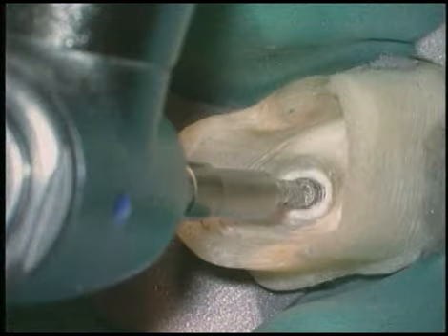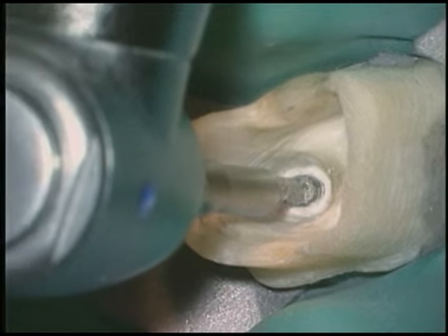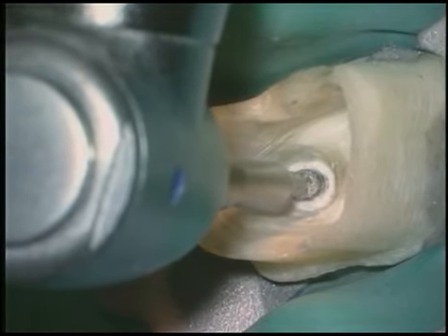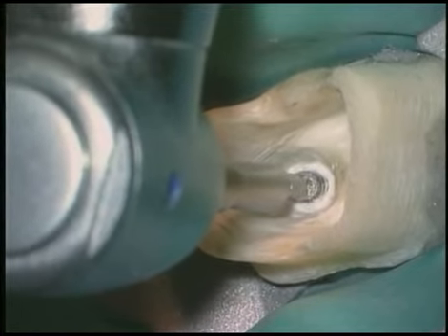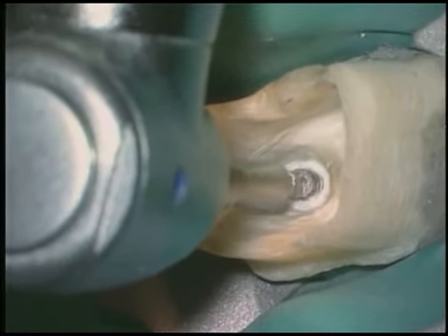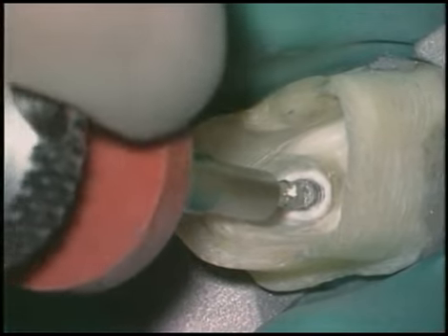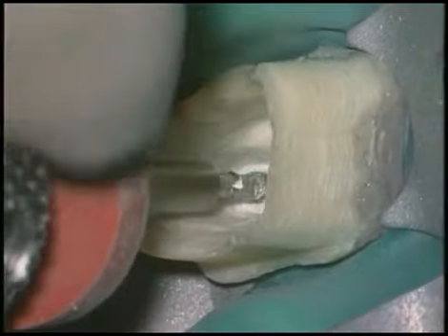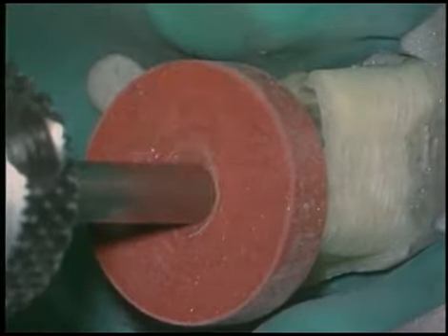If the post doesn't budge in that time, then we need a fallback option. The Cavo slow-speed electric handpiece can easily machine down a post with an appropriate trephine. Pumping action will allow the post to be machined down about 3 millimeters. Take the correspondingly sized tubular tap. Short little counterclockwise rotations begin to draw the tap down and securely engage it to the post. Now push the bumper down over the occlusal surface.